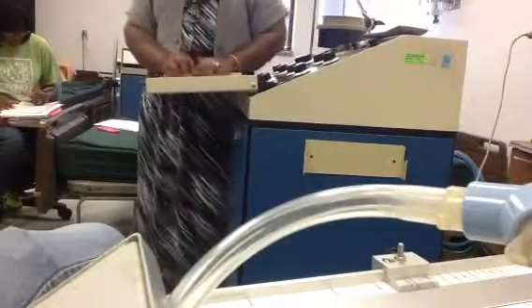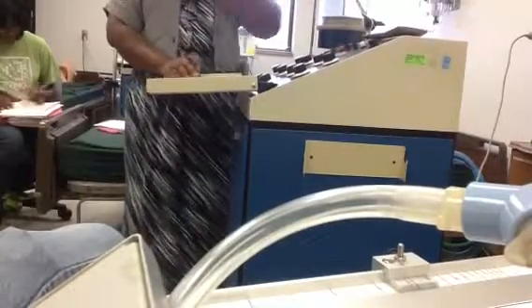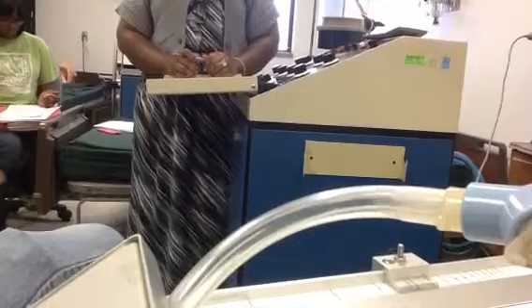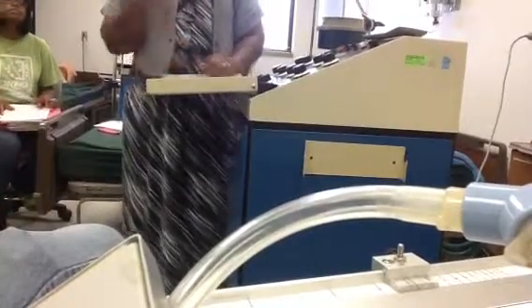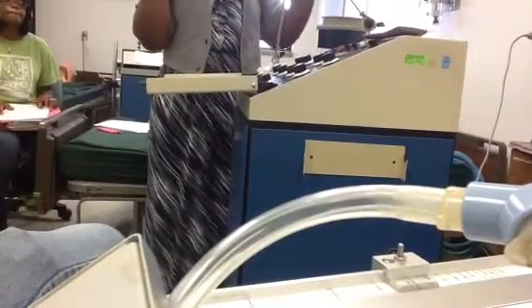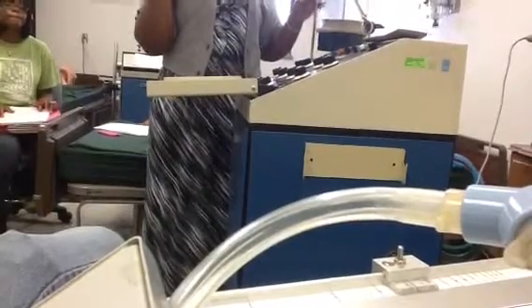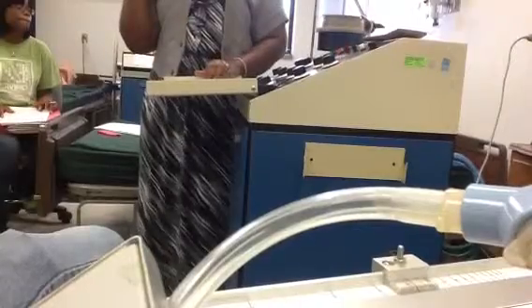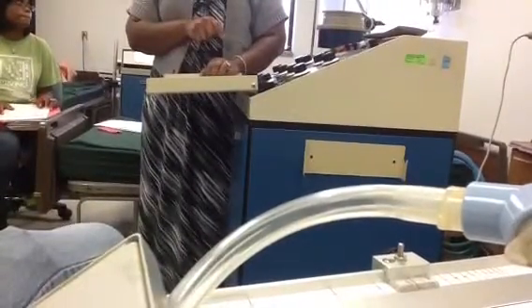So we just count. Total rate can change. We count how many times the assist light comes on, how many times your patient breathes a minute. And you would know how many extra breaths they triggered by subtracting your set rate from the total.